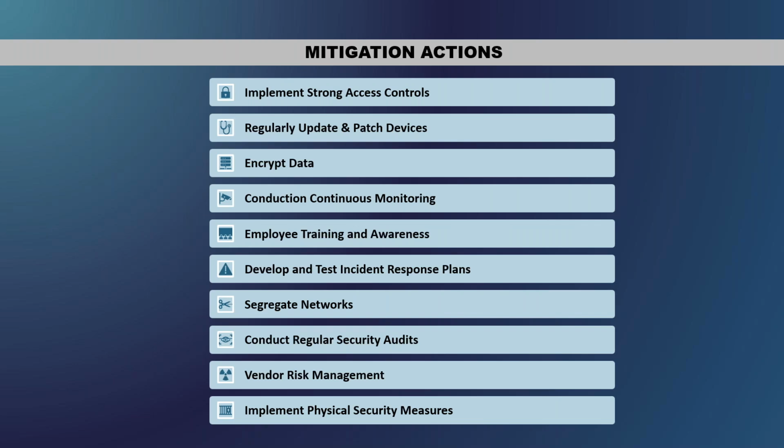So performing those periodic security assessments and making sure that all the risk assessments and the controls and securities that you've put in place, you're analyzing that and making sure that your device is holding to that control. Don't say, oh, well, this risk assessment said I'm going to turn off the service and block this port, but then you go in and check your workstation and all the services are still open, your firewall is wide open and everything.